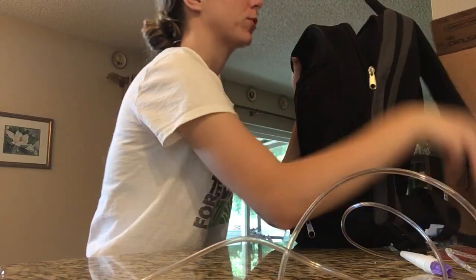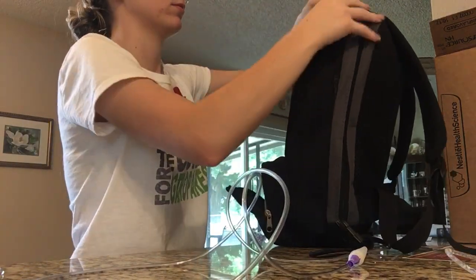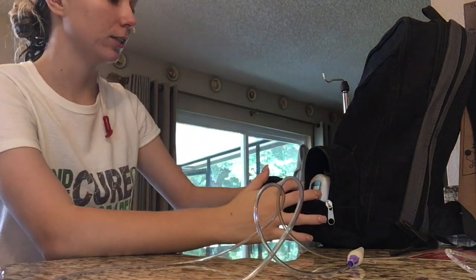And then I'm going to prime my pump so I don't pump a bunch of air into me. So I'm going to turn my pump on. I'm going to press clear settings.